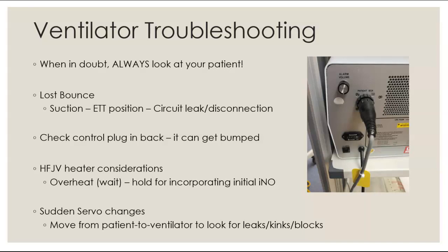And then moving on to a lost bounce. If we have a lost bounce, my first thing to do is check my ET tube. Make sure it's in good position, where I measured it, where it needs to be. Do I need to give a little bit of tension? Do I need to push it in just a tiny bit? I do that without unsecuring my tube. I just put a little tension on it.